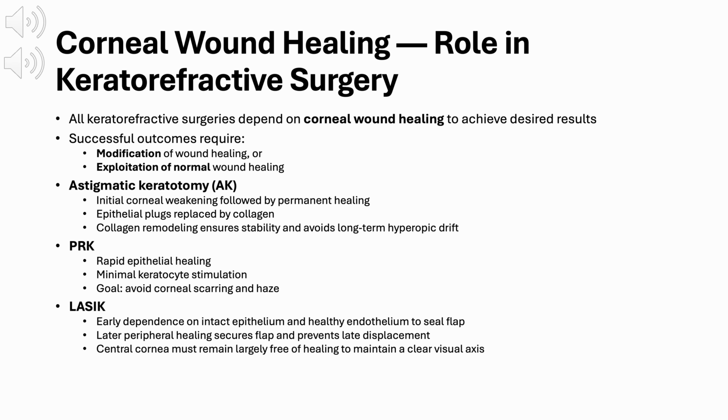LASIK relies on yet another wound healing strategy. Early on, the procedure depends on intact epithelium and a healthy endothelium to create a fluid seal of the flap. Long-term stability comes from peripheral wound healing, which secures the flap edge and prevents late displacement. At the same time, the central cornea must remain relatively free of healing, because any significant healing response in the visual axis degrades optical quality. So across techniques, the theme is consistent. We're not just reshaping the cornea, we're carefully engineering where healing happens, how much healing happens, and where it must not happen.